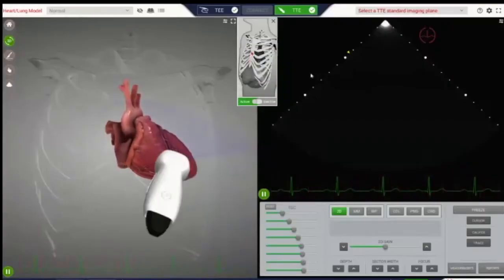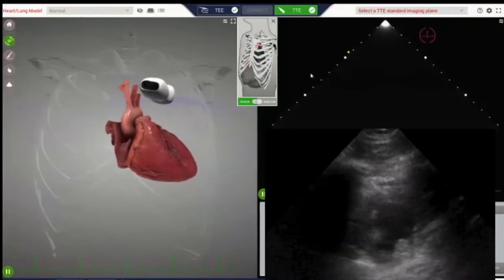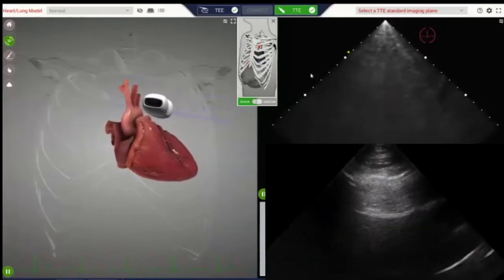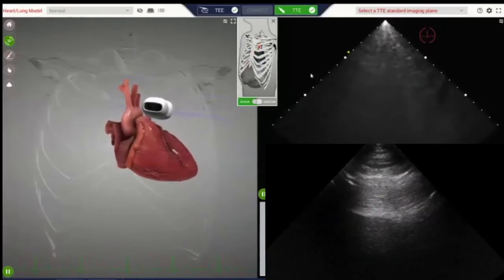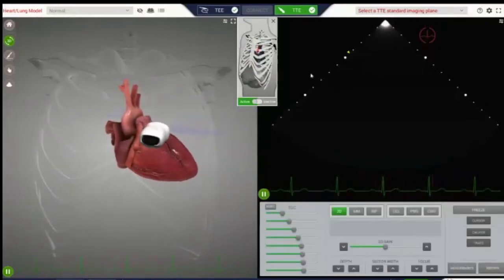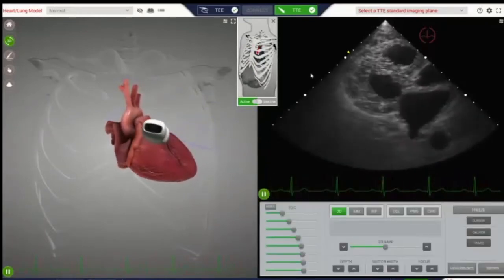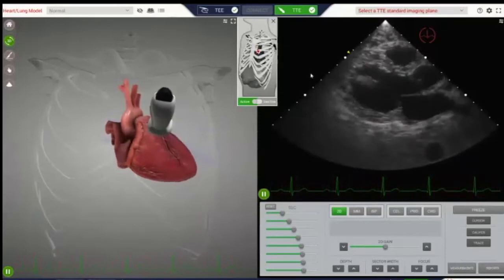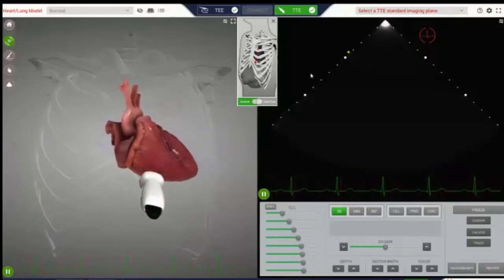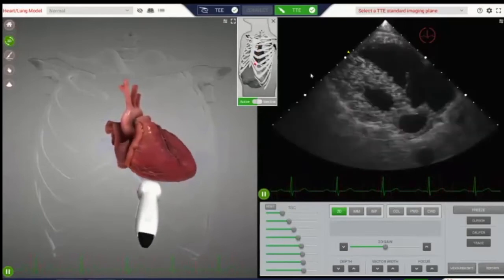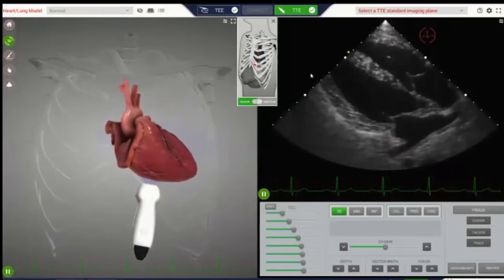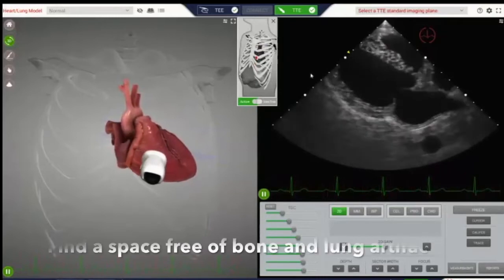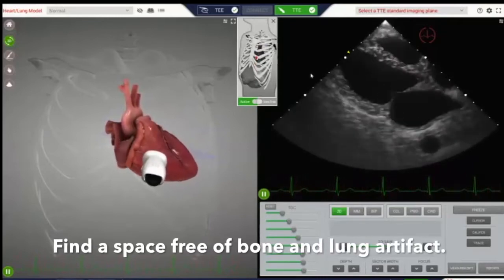On the simulator you'll see bone shadowing from ribs as anechoic bands on either side of the heart. You'll also see horizontal lines called A-lines when the probe is over lung — these are a type of reverberation artifact. As you move more inferiorly, you encounter cardiac motion. Recognize that the more superior your position, the more inferiorly you need to fan; and the more inferior your position, the more you need to fan superiorly to image the heart. Most people have at least two intercostal spaces to work with, so find one that is free of both lung and bone artifact.